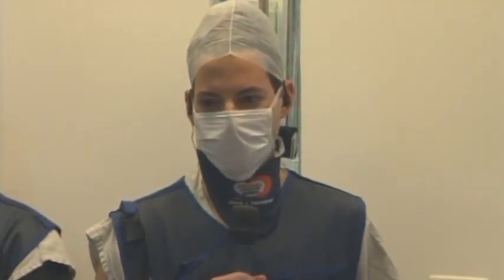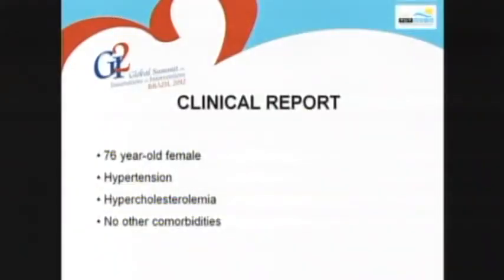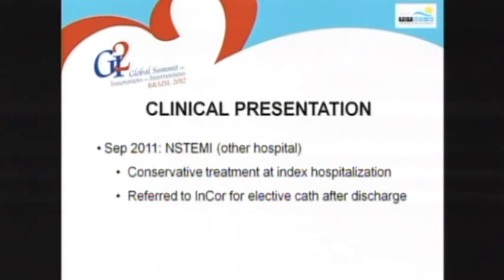Good afternoon, everybody. I'll present this case today of a 76-year-old female with a history of hypertension, hypercholesterolemia, and no other comorbidities, who presented in September of last year with a non-ST elevation myocardial infarction in another hospital, which was at first treated conservatively, and then at discharge referred to Incor to us for an elective study of the coronary anatomy.